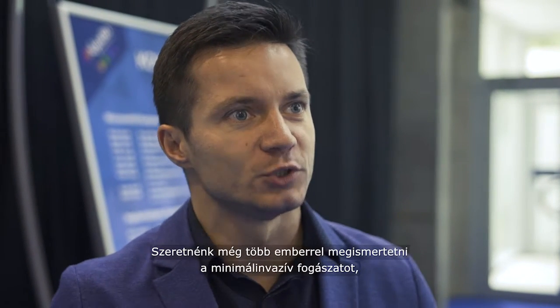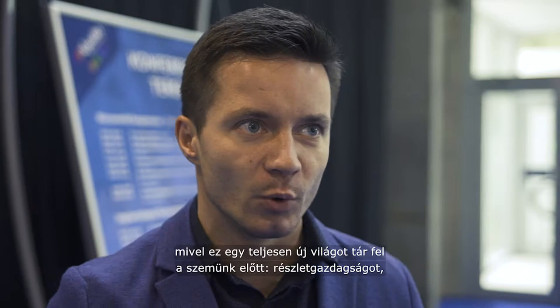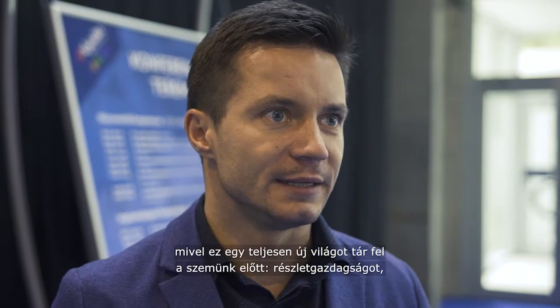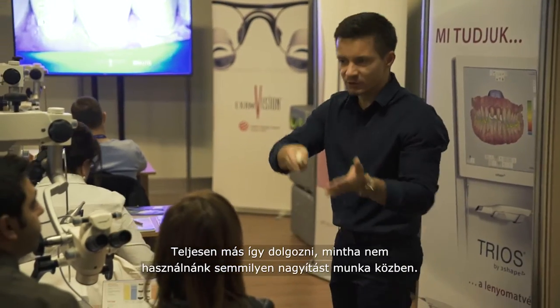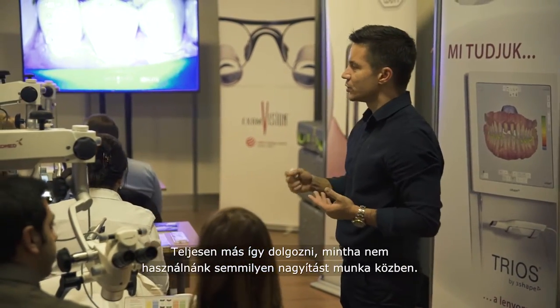We are trying to bring people more into minimally invasive dentistry because it's a whole new world. The details, the precision, the control, the ergonomics are totally different than when you're not using magnification.